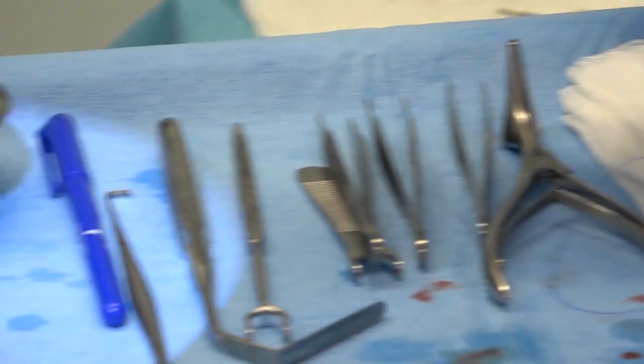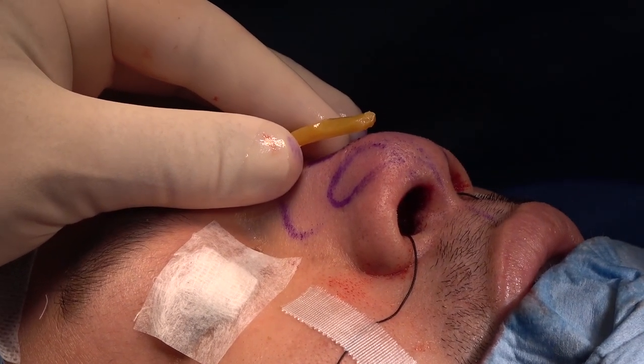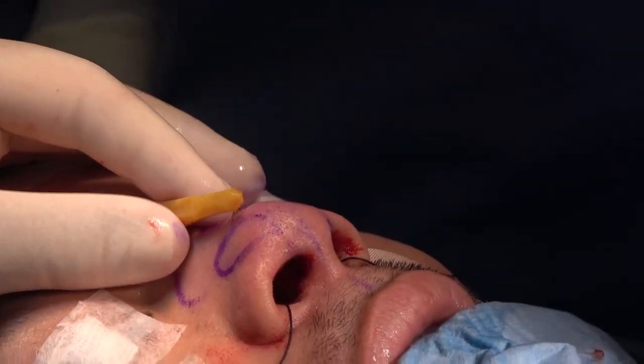Graft. Yeah. And this side. So we'll be using this type, similar to this. Can you show the opening up the graft? It's homograft, as you see, so we have already small beads ready. Okay, that's fine. Thank you. So this graft will go there. And we'll place the graft now.